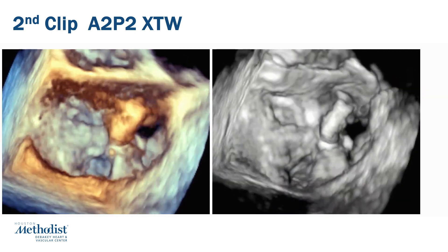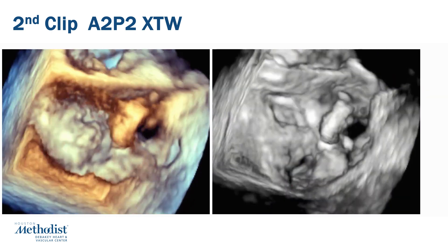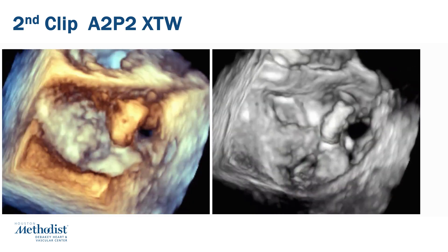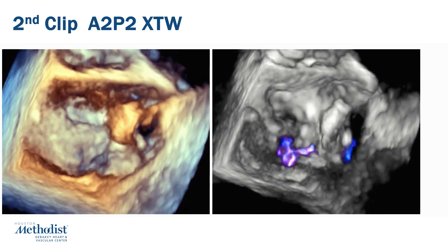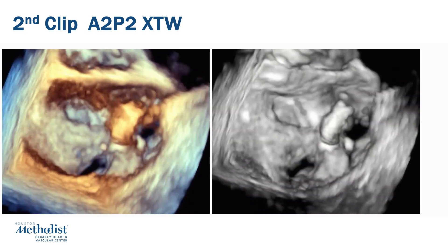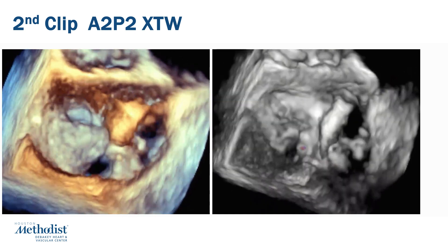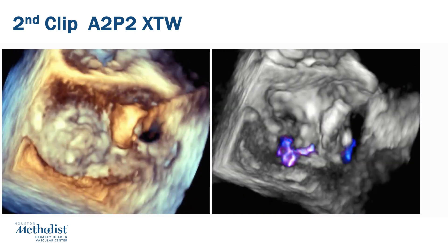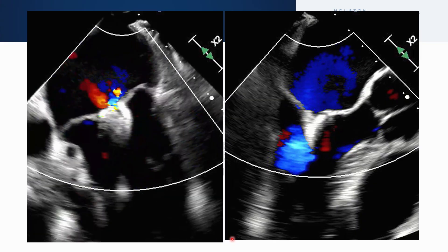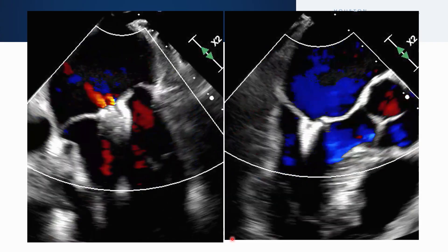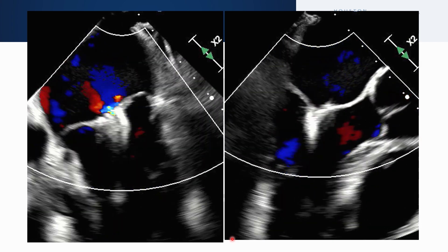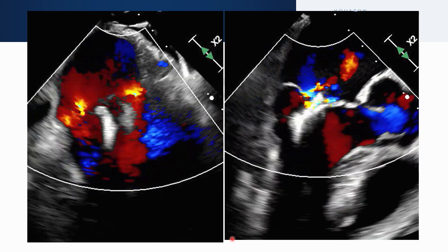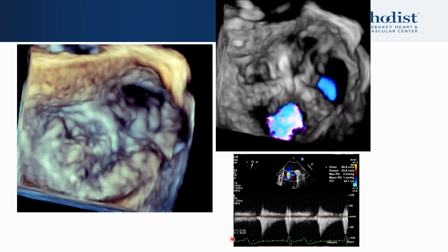On the 3D with and without color, you can see the second clip is in the A2-P2 scallop region. The mitral regurgitation is very successfully nearly abolished, with only a very trivial amount of mitral regurgitation between the two clips, as noted on the 3D color image.